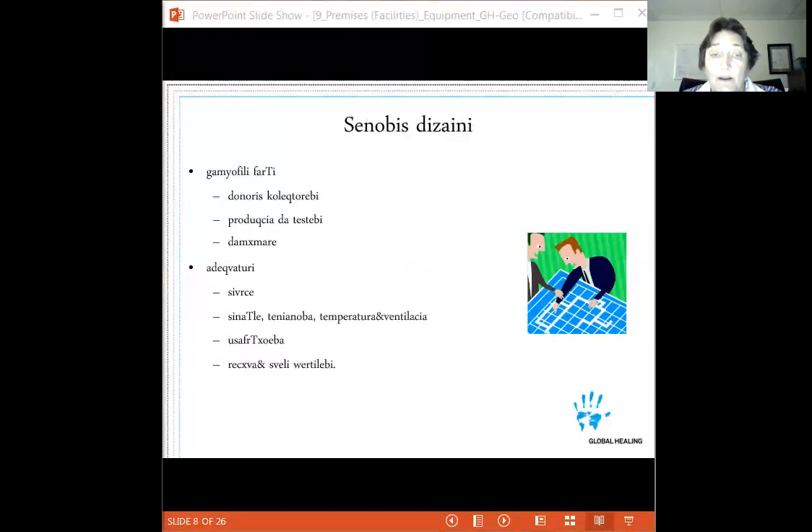For a donor center, we really should have separate areas for each major function: a separate area for donor collection, a separate area for production and testing, and a separate area for ancillary services like quality and administration. We want products in a cleaner environment, and we don't want donors back in the testing area where cross-contamination could occur in either direction.